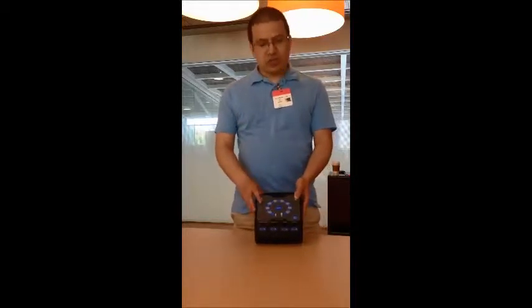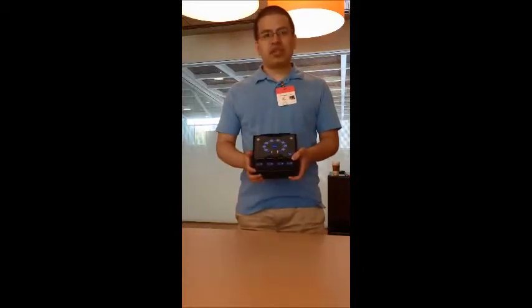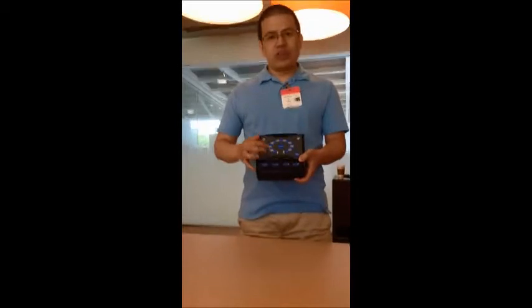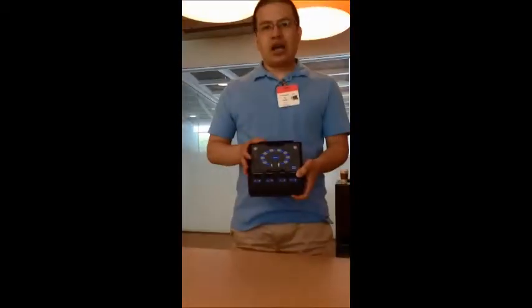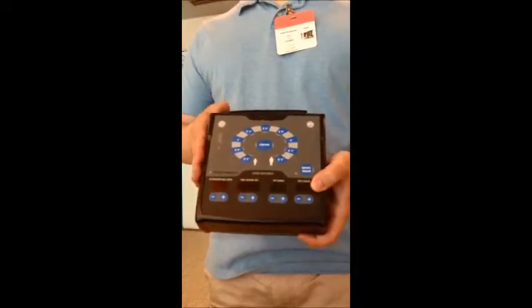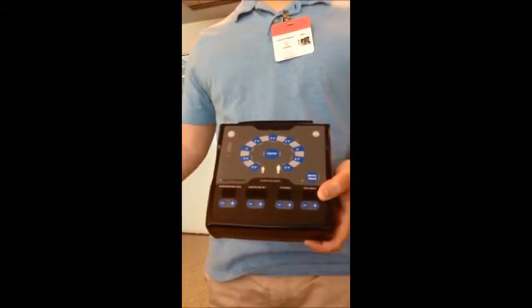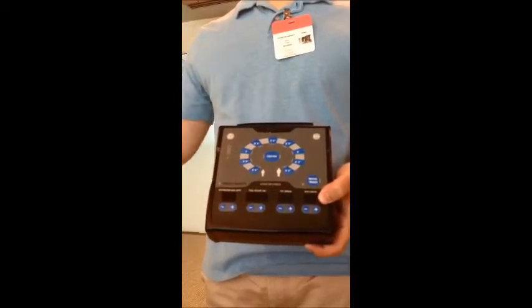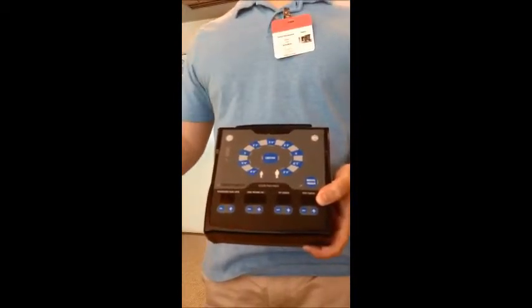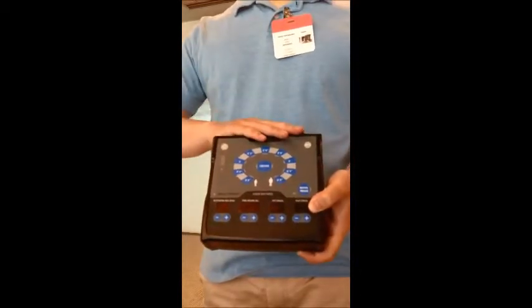So as you can see from this particular ventilator, when a user first comes up to set this up with a patient, all they have to do is select the patient's height. The purpose of that is that when you choose the patient's height, you can then calculate the ideal body weight of the patient. This is something typically the user will have to calculate themselves and then take that ideal body weight and turn that into another calculation of what is the appropriate tidal volume. This device will do all that for you.